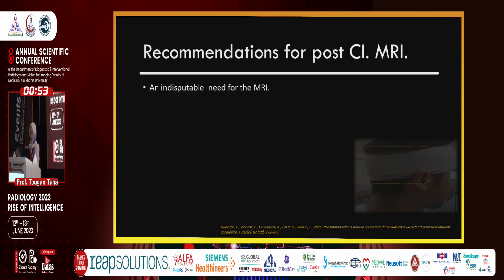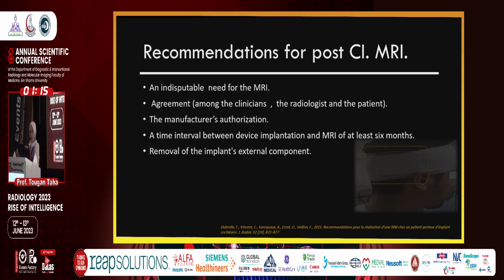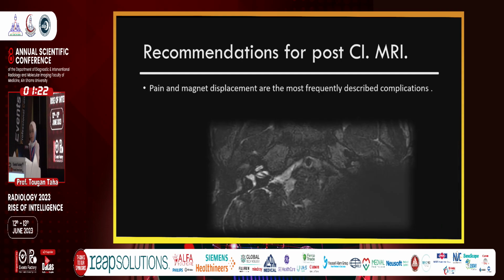So what are recommendations for post-cochlear implant MRI? An indisputable need for the MRI, agreement among clinicians, radiologists, and the patient, the manufacturer's authorization, a time interval between device implantation and MRI of at least 6 months, removal of the implant's external component, and close-fitting compressive bandage.